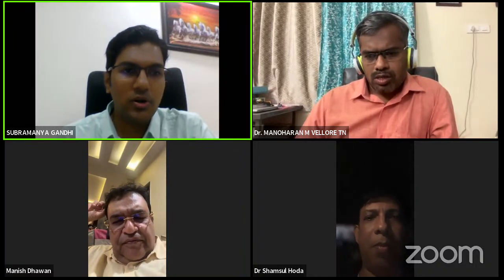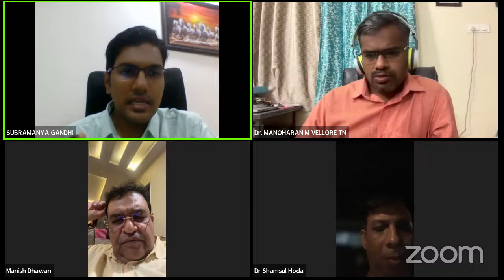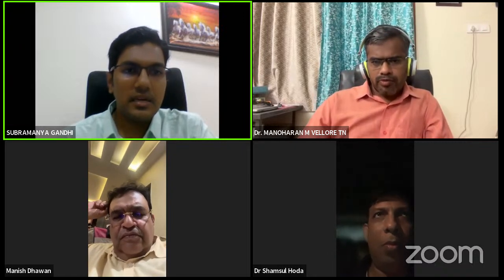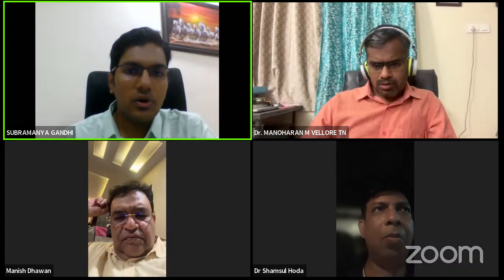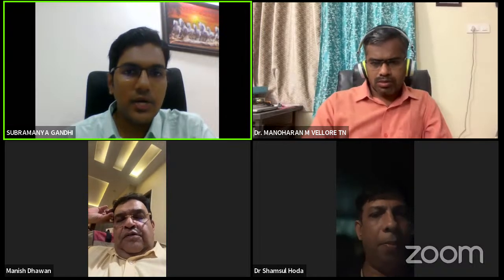Sir, one more thing which I missed in the talk. Dr. Manoharan sir has correctly brought up a very, very important point: when you use a dynamometric wire tensioner, if it is going to be a full ring, try to use the same tension in the wires applied in that ring. If you are going to apply 110 to a particular wire, try to use 110 on the other wires in the same ring. If it's a drop wire on a post, that is different. But if the wire goes through the ring, then try to apply mostly the same tension in all the wires.